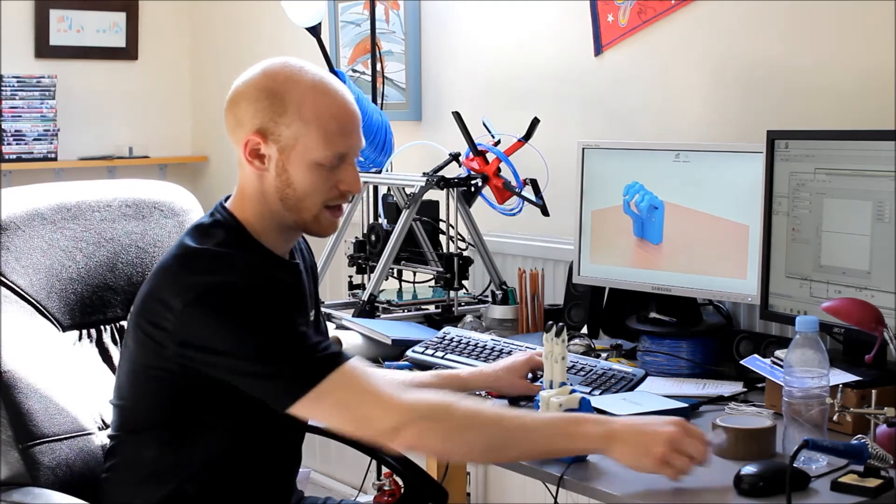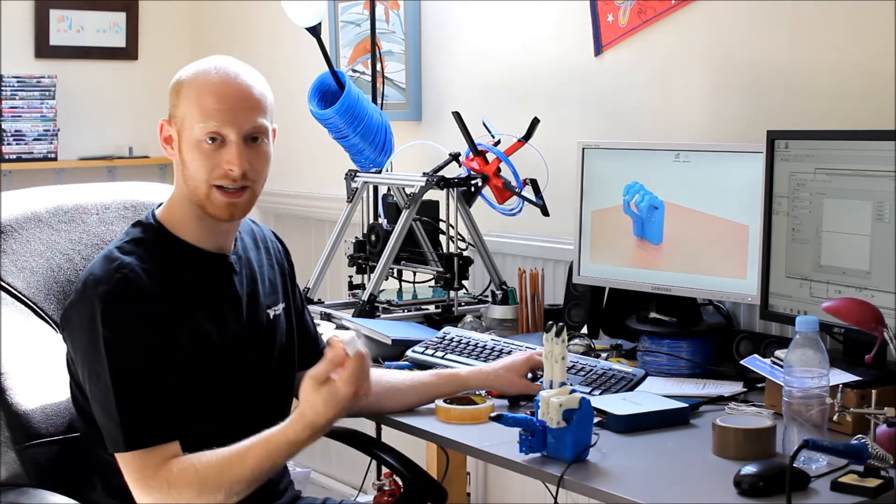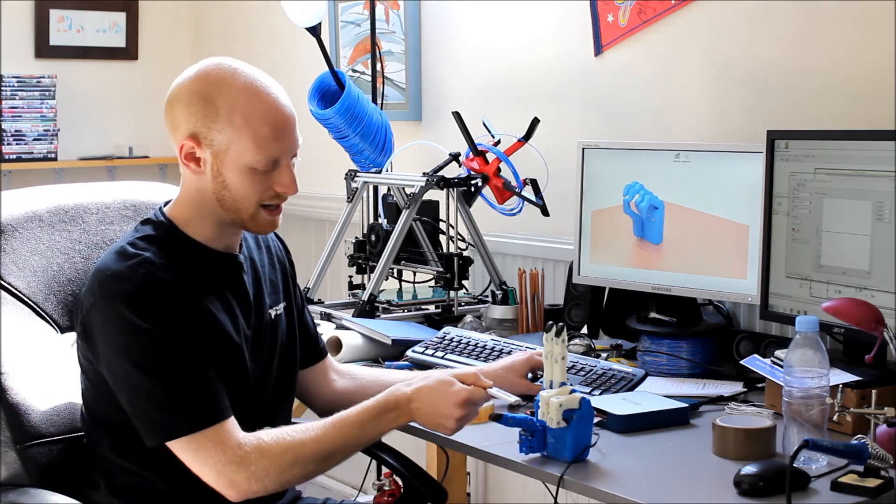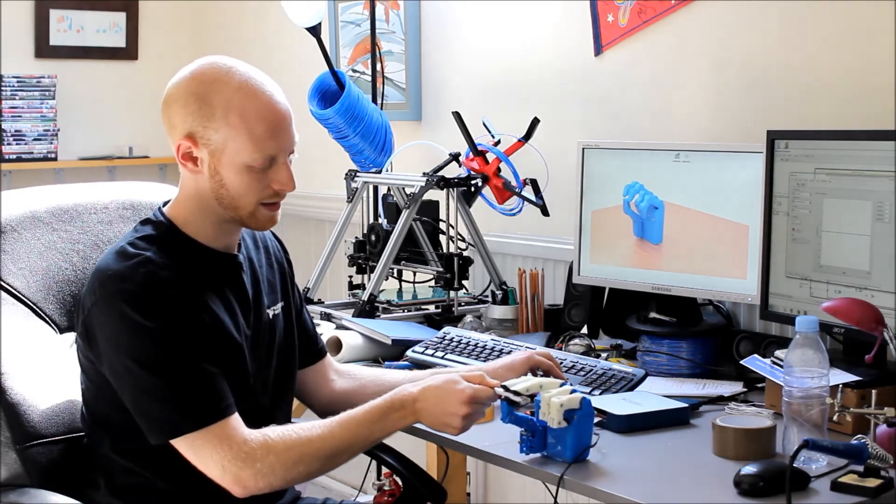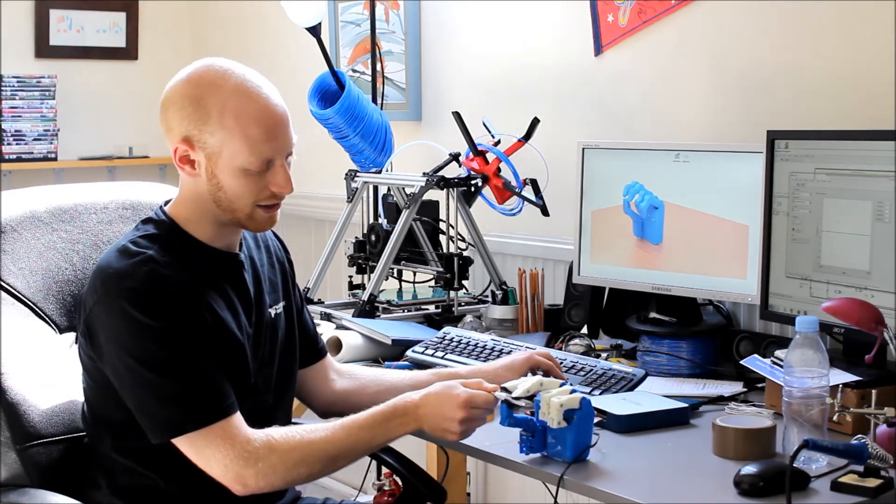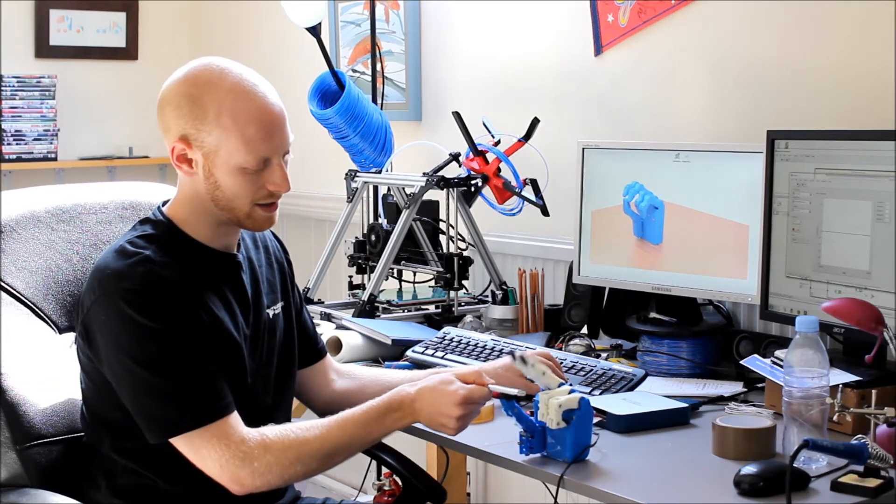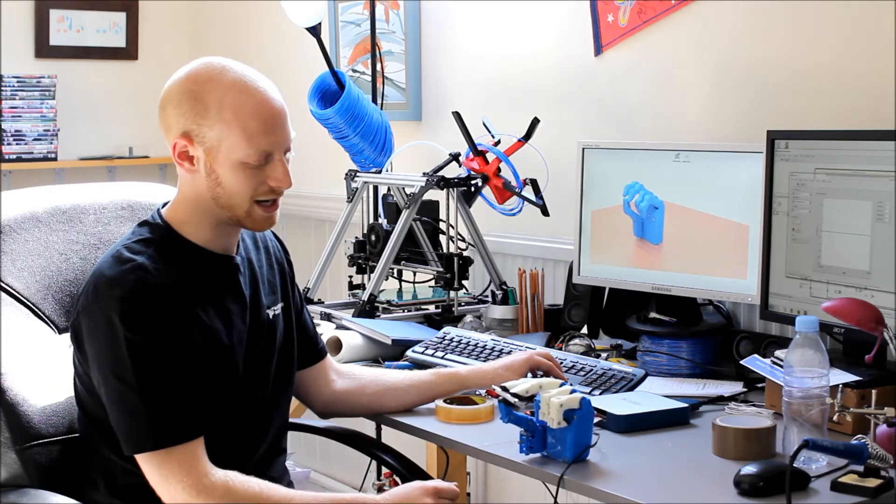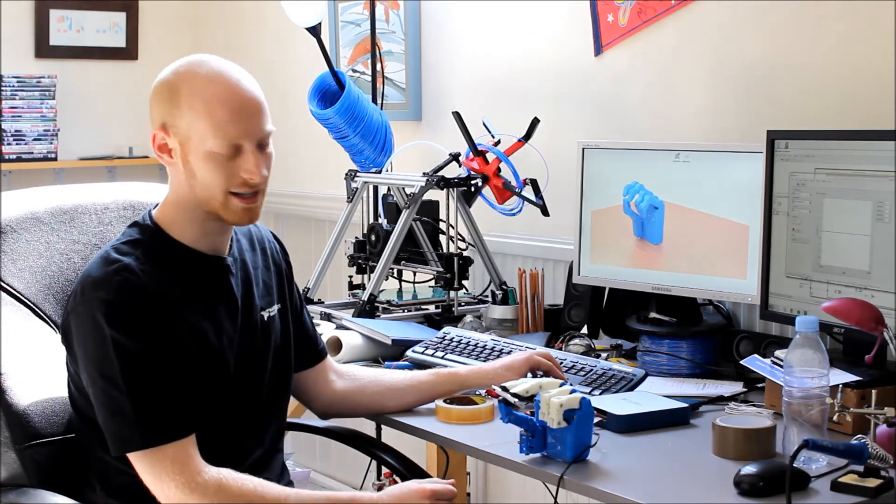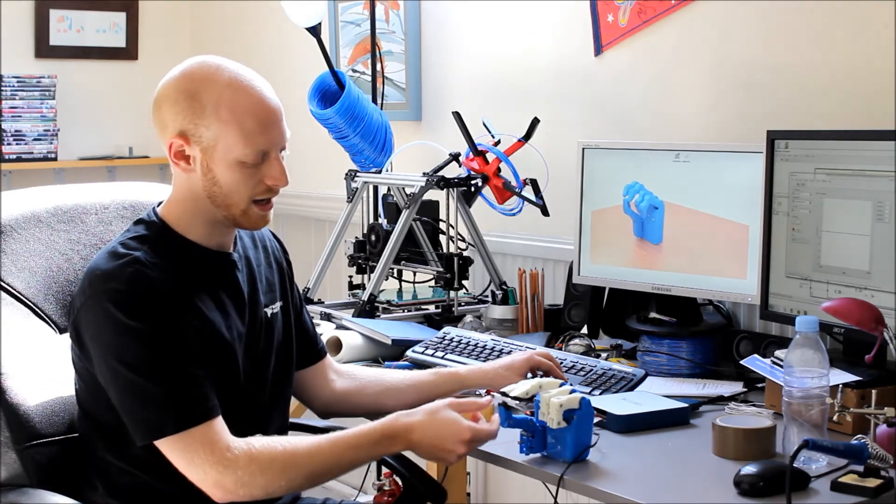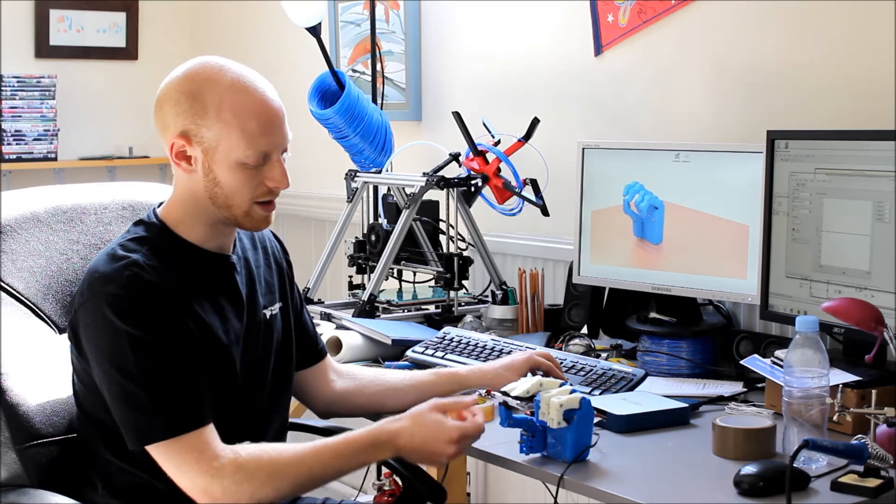So I grab something like a USB stick. You can see it grabs that. I slightly missed the grip there. You can see it grabs that quite easily. You can tighten the grip as well.